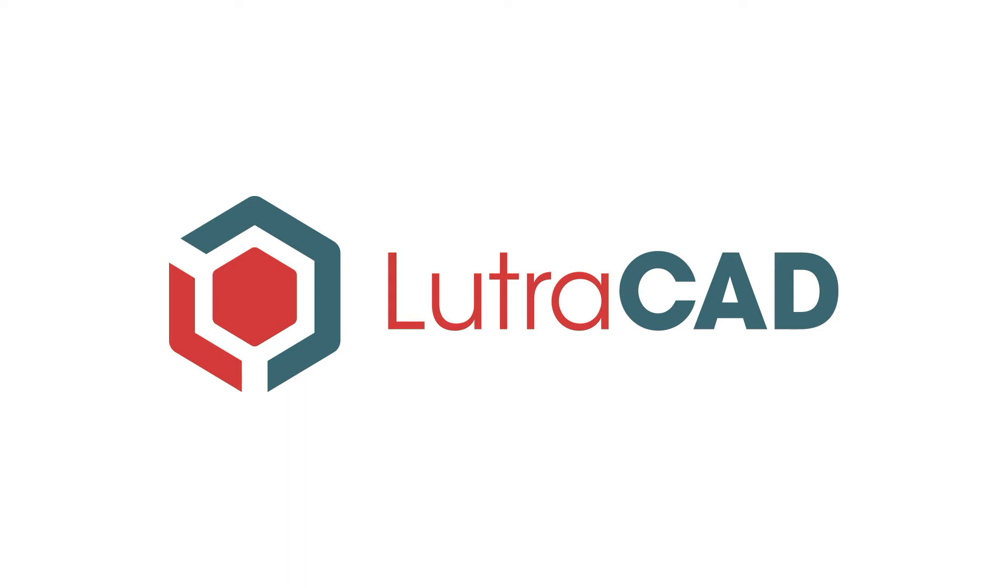Welcome to the introduction videos of LutraCAD. This is a video about designing an insole based on a 3D scan.